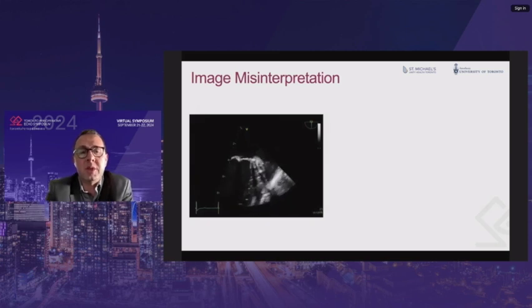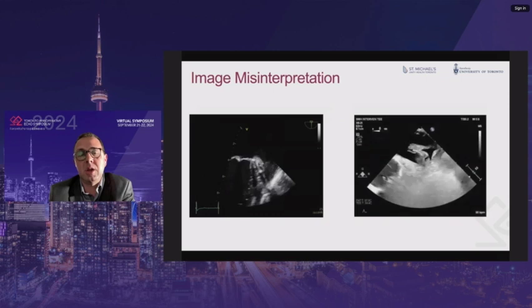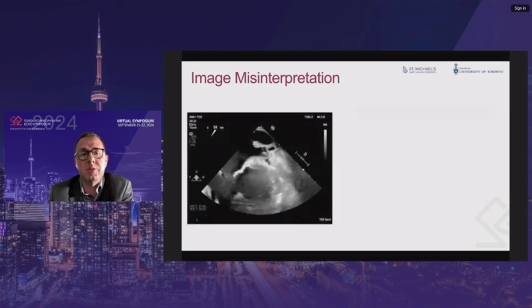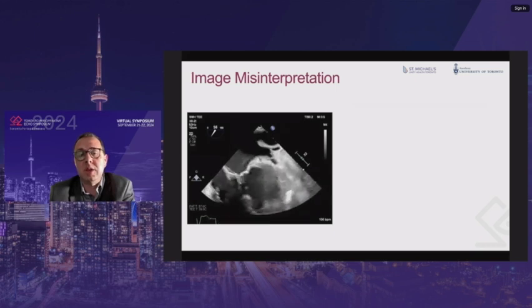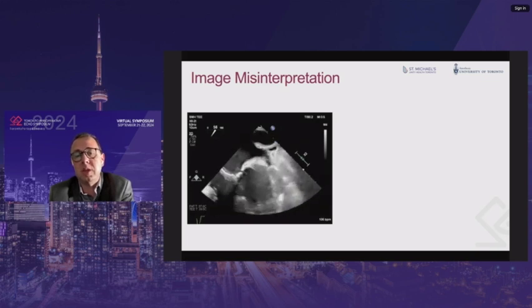So, the left atrial appendage: it is always important to make the diagnosis of low flow causing smoke or even creating some thrombus. This is easy to diagnose, but what happens if you have a patient coming for a cardioversion? You do a TEE to rule out left atrial appendage thrombus, and you see this image. Would you cancel the case, send the patient home for a few more weeks of anticoagulants to bring him back for another echo and then shock?